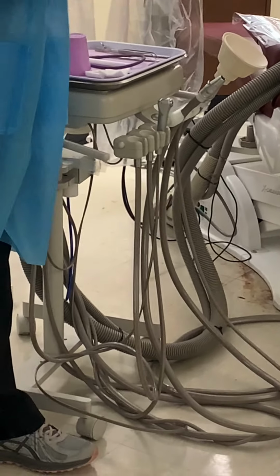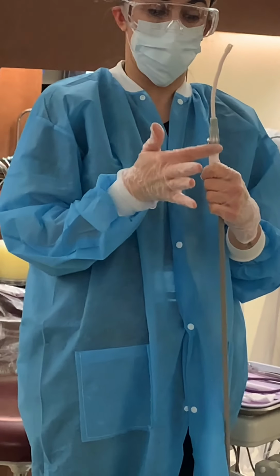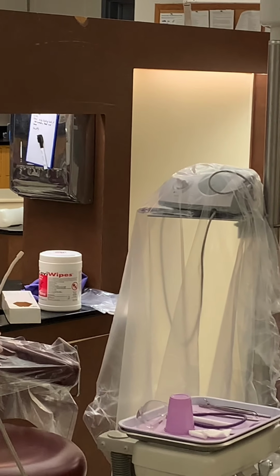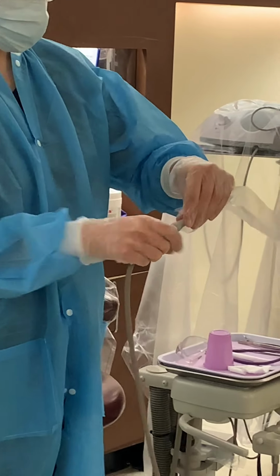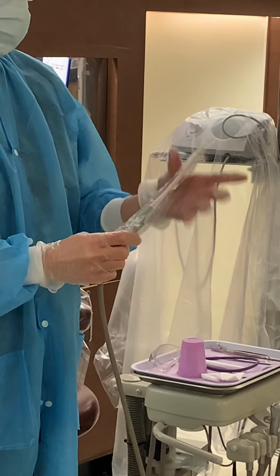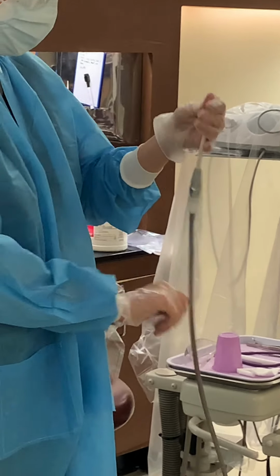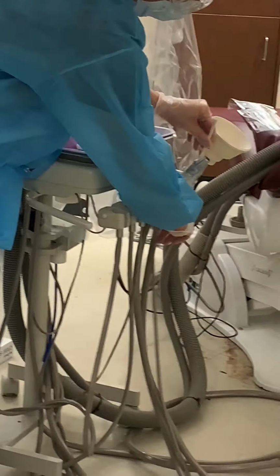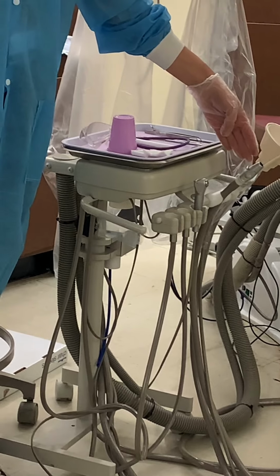Your saliva ejector will go inside here. And now if you can imagine, this is a lot of little nooks and crannies to put a lot of bacteria. So an easy way to keep this nice and protected is an air-water syringe cover. Typically they have slits. If they don't, just rip it through. Get off that little piece. There you go. So now that's protected. And then we would do the same thing for the HVE as well.